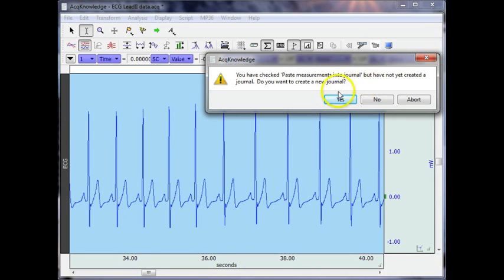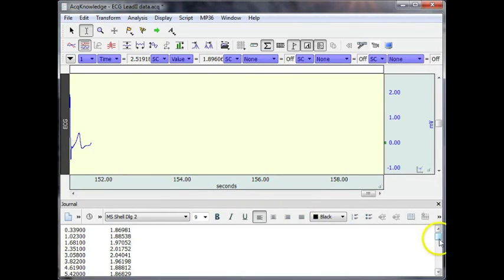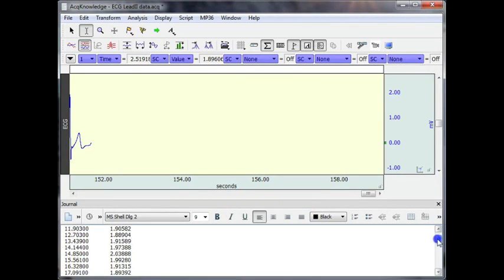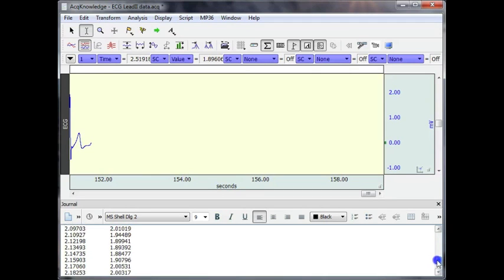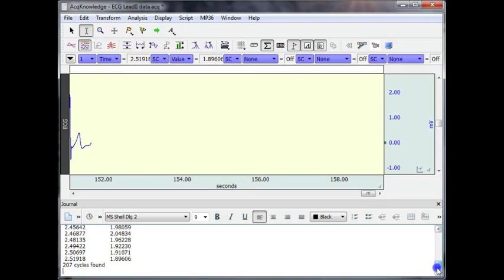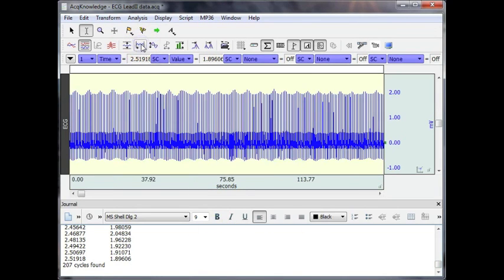It's now asking me to create a journal or open a new journal, I say yes. And there we have it, the software has run through and it's given me the time and the value for 207 waveforms. This is the entire length of my file.